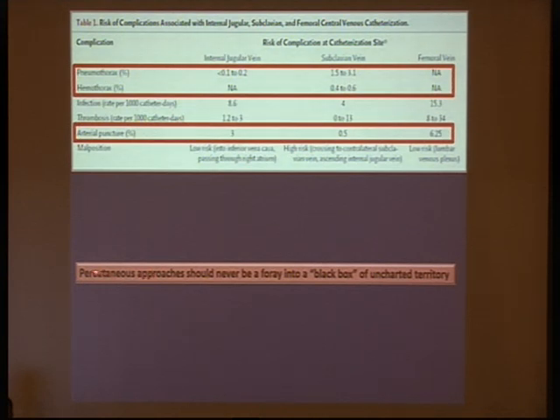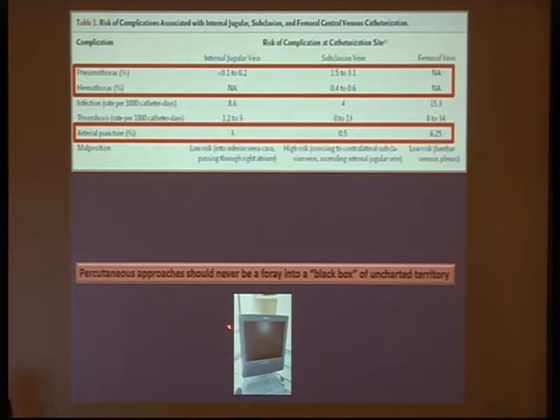We should convert the percutaneous approach from a blind technique to a visualized one through the use of ultrasound guided insertion.